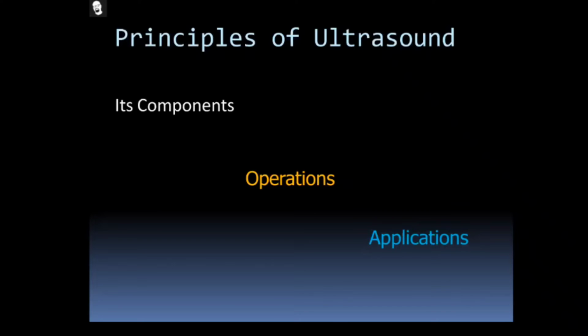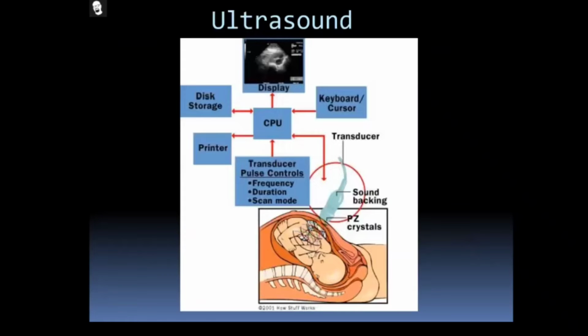Three days before, we conducted a workshop on the ultrasound machine, on how the machine functions and how things happen. Over those three days we learned many things about the ultrasound machine. I will also share a demo video of the ultrasound machine along with your recorded video.